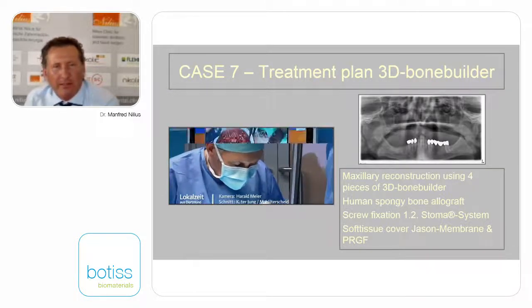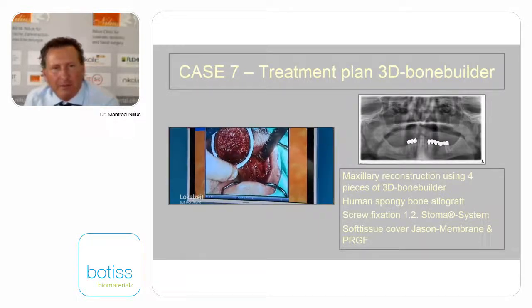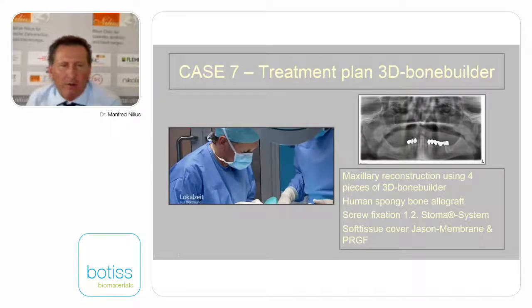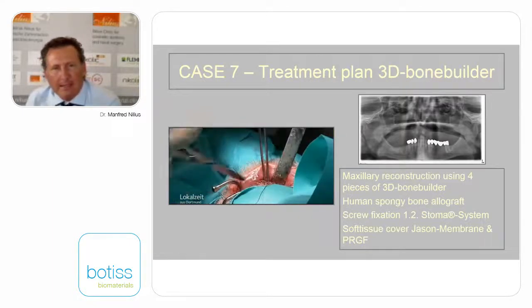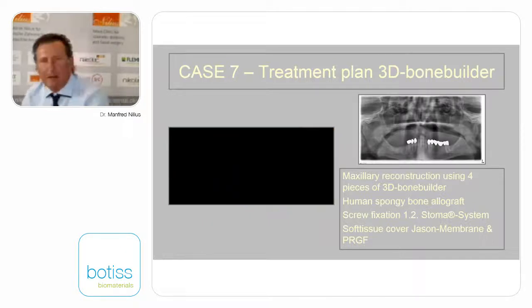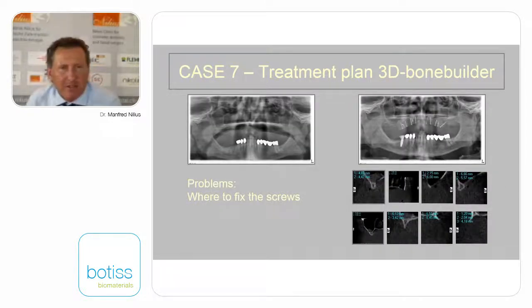Almost 2 hours by operation. You can see the intraoral part and fixation. The patient starts explaining what will happen next, and this is a clinical situation you have. And when you would like to do this operation again, there are some problems you will figure out.